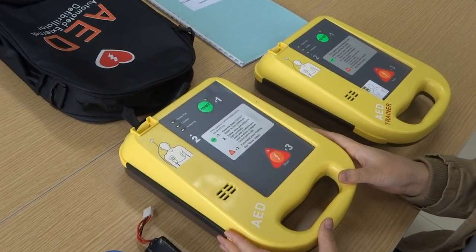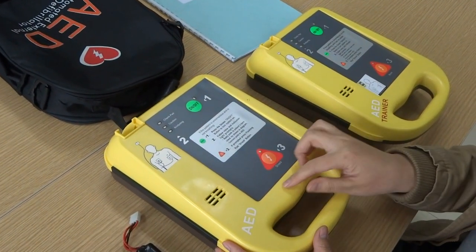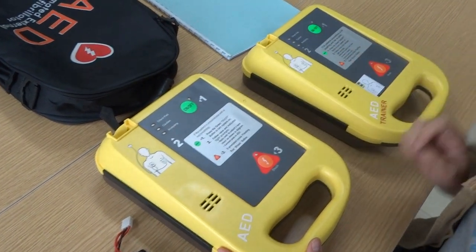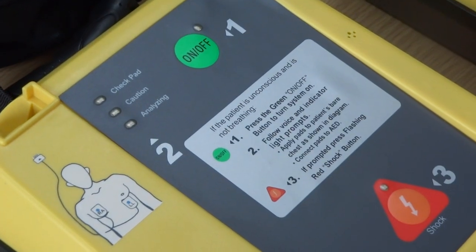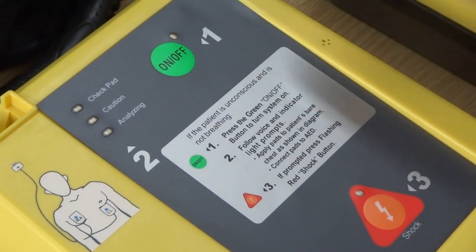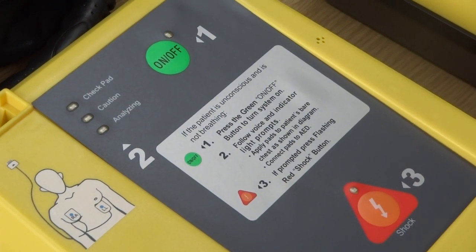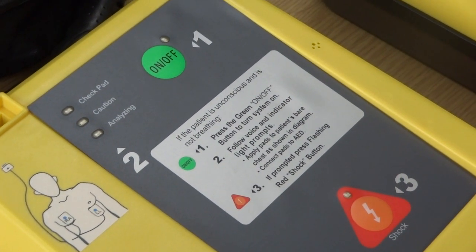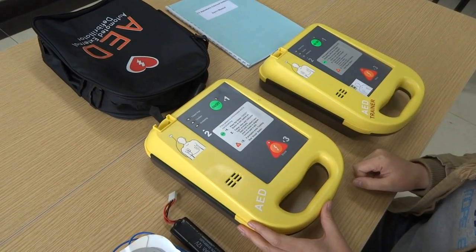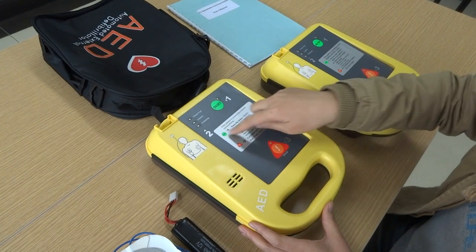This is the hood of the AED. On the main interface, we can see three LED indicator lights and two buttons. One is a green on/off button, and the red one is the shock button. All of our operations will rely on these two buttons, along with some tip text.